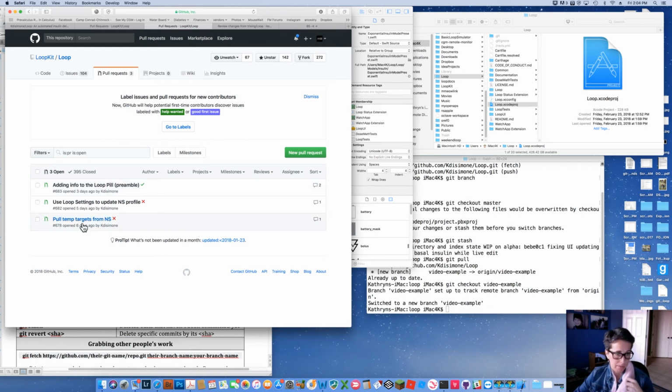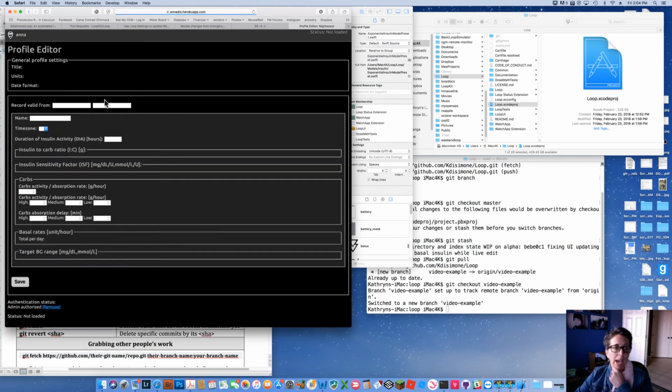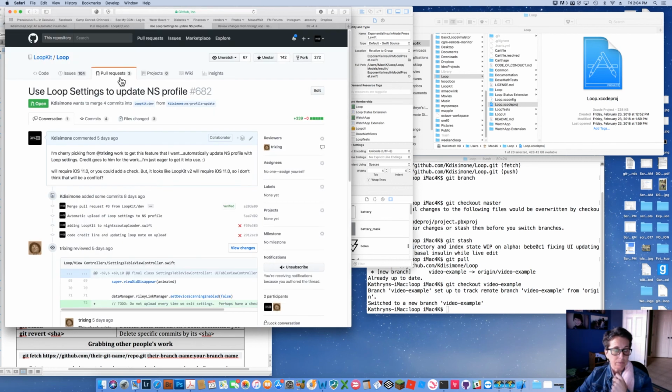For example, this one uses Loop settings to update Nightscout profiles. So this one basically is a feature that I think would be cool, is that if your Loop settings change on your Loop app, like you change your basal rate or you change your ISF or carb ratios, that this automatically updates your Loop profile or your Nightscout profile over here to match. So these get updated automatically, which would be really cool. And it works. And I think it's really, really neat. So I put that request in here.